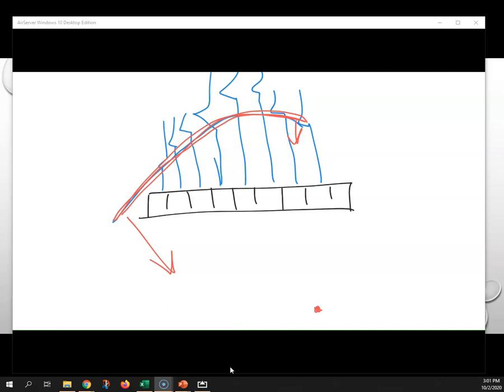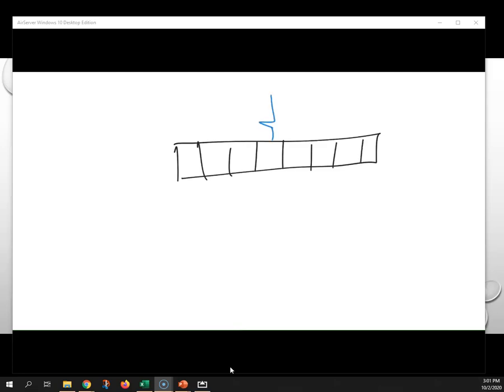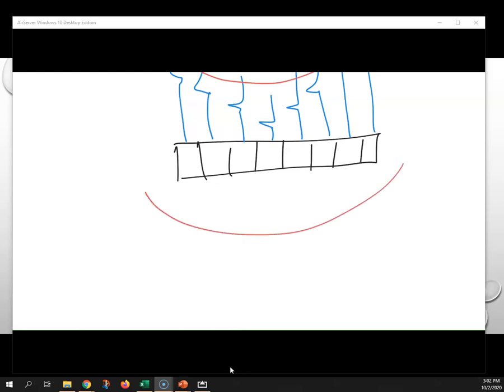And then there's one more concept I want to discuss about this, and that's, sometimes you'll hear about the defocused beam, and that's what they're trying to say, something like this, in that if we fired it off in the center first and then made a concave, I don't know, convex, concave, whatever, this kind of firing pattern, you see, this is not focused. This is already diffusing, or not diffusing, what's the word I'm looking for?